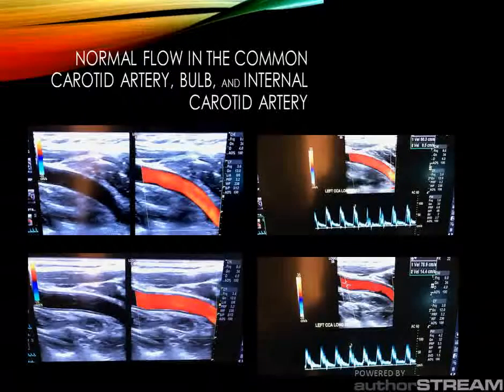You can also see normal systolic and diastolic wave patterns since the common carotid artery feeds the external and internal carotid arteries. It must display a combination of high and low resistance.